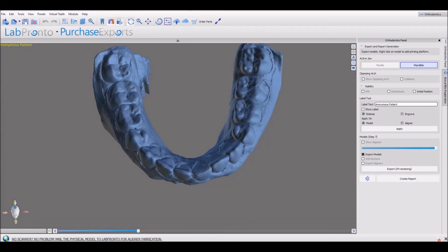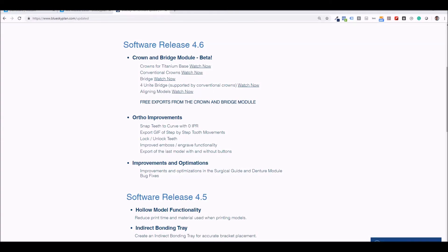We have also optimized, improved and removed issues in the surgical guide module and denture module. Scroll down to see more information and links to video tutorials.